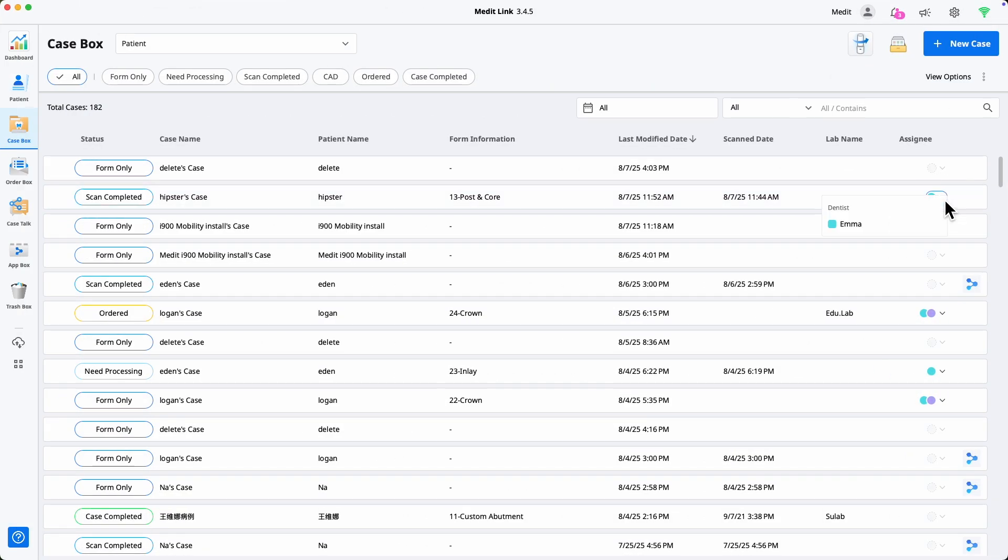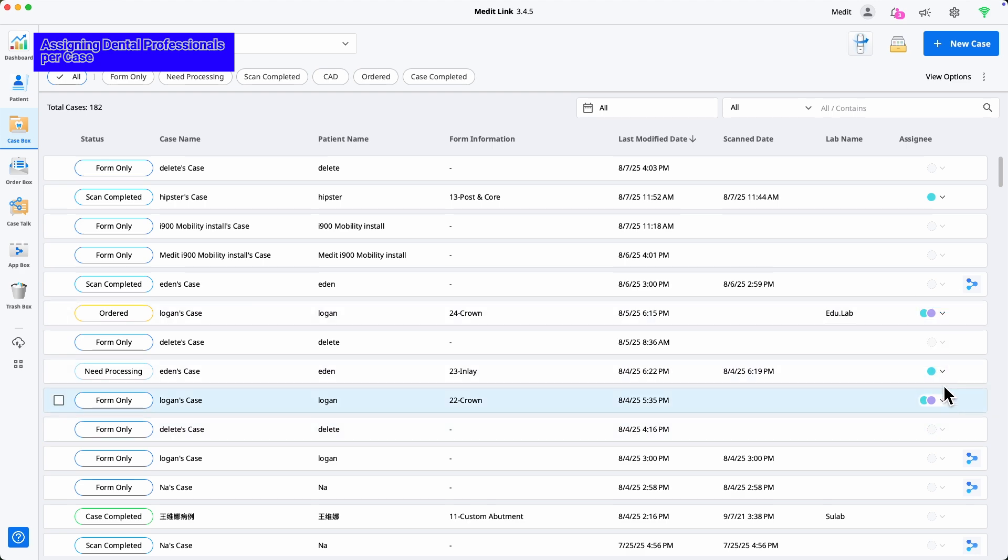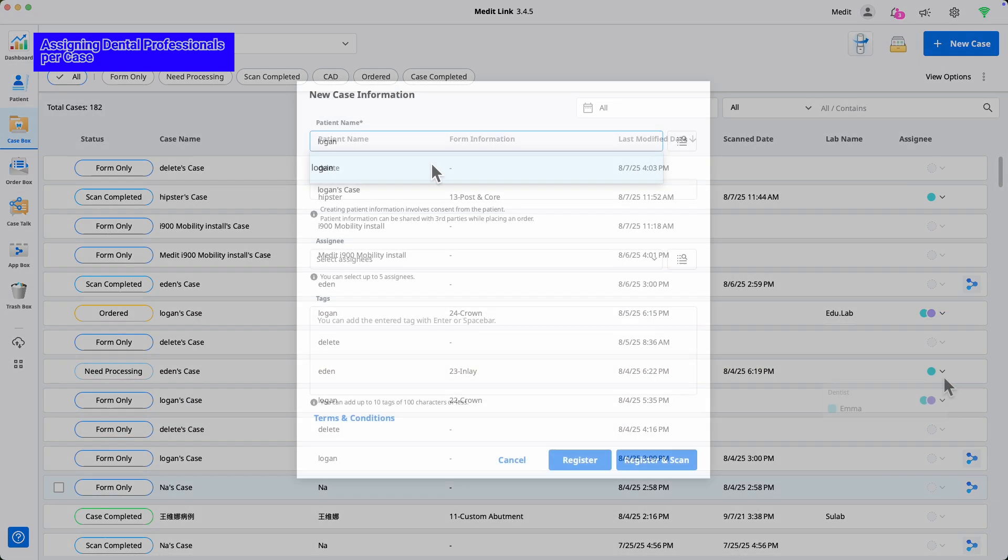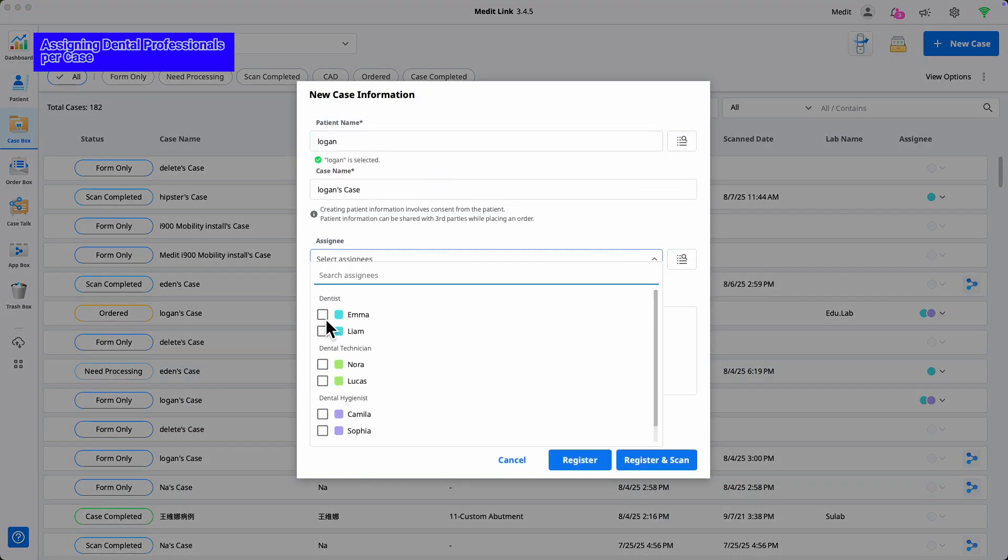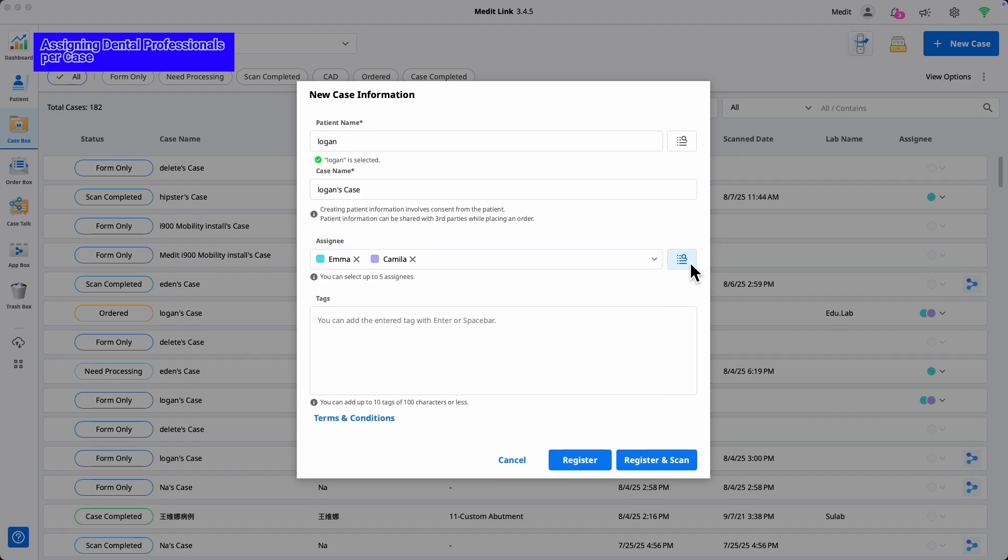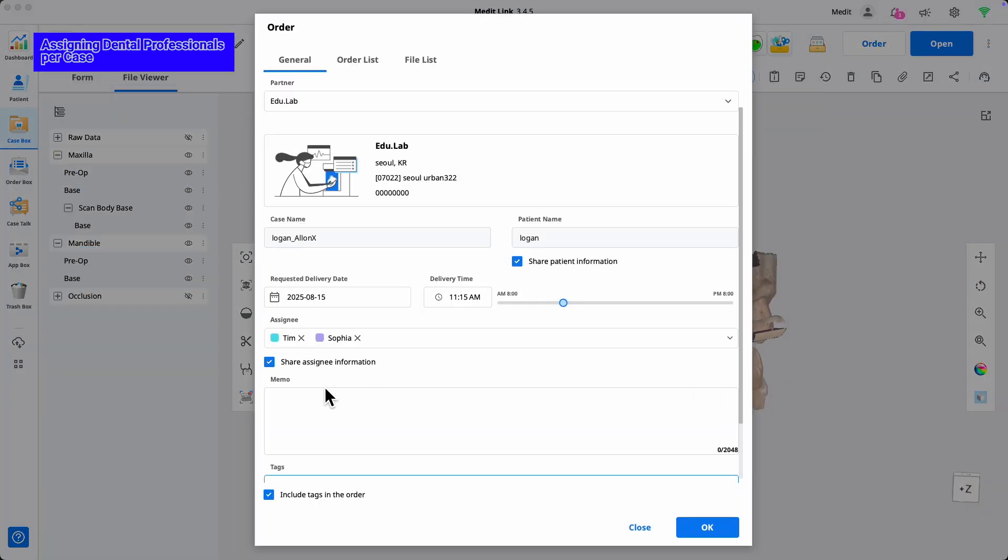Now each case can show its assigned person, so you'll always know exactly who to communicate with. You can assign and record a staff member or the responsible doctor when creating a case. At the ordering stage, you can choose whether to share the recorded assignee information with the lab.